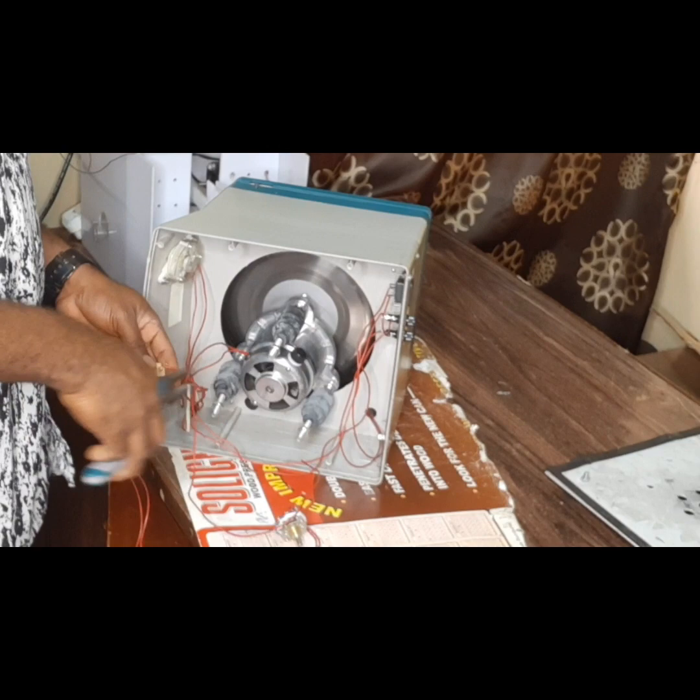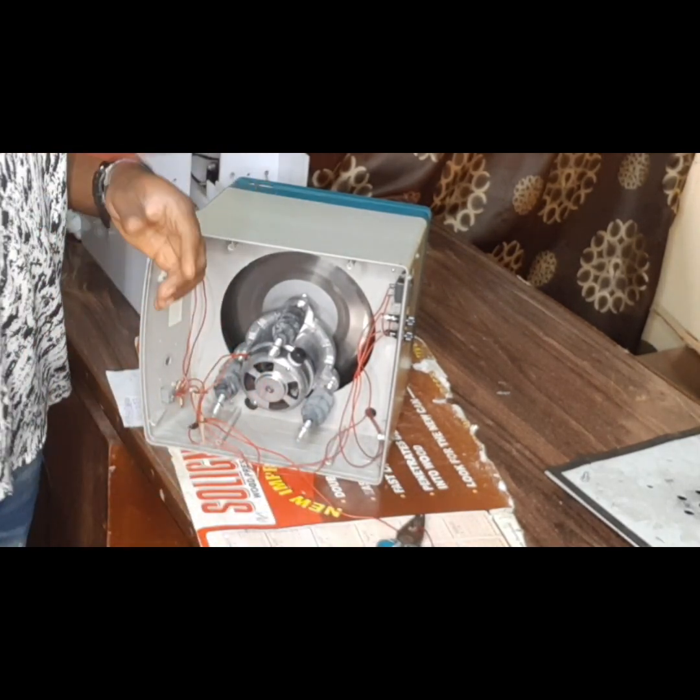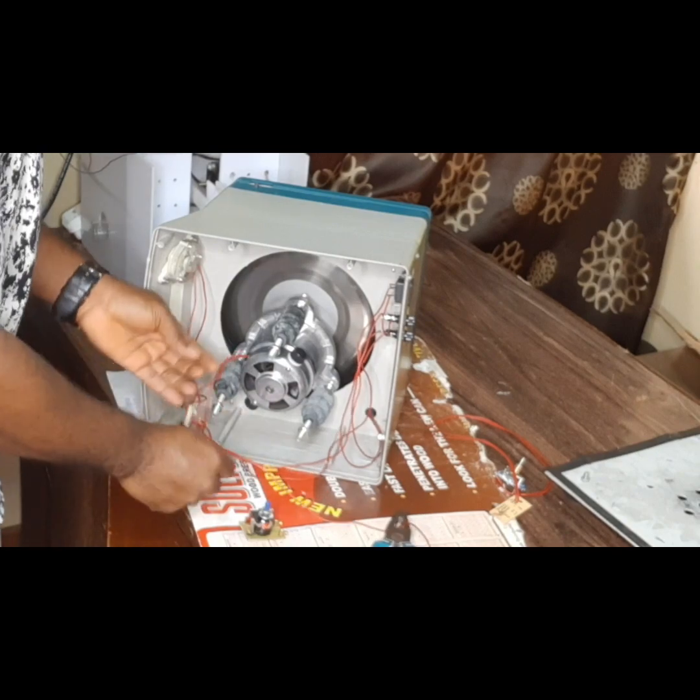I hope you guys are seeing what I'm doing. So I've been able to dislodge this. I am not going to use this again. So I will introduce a new one right here before us.